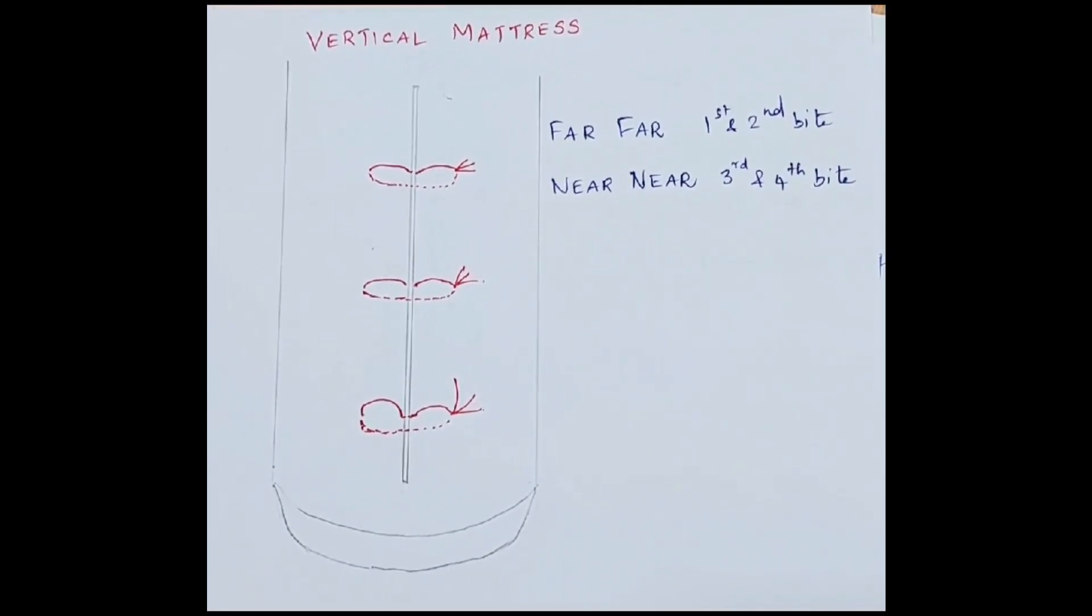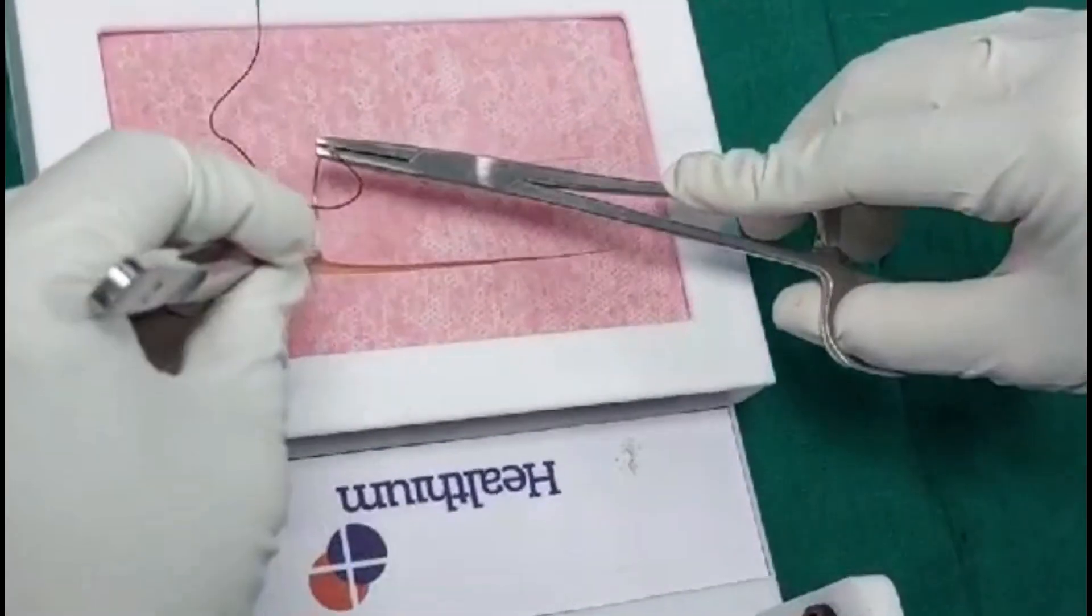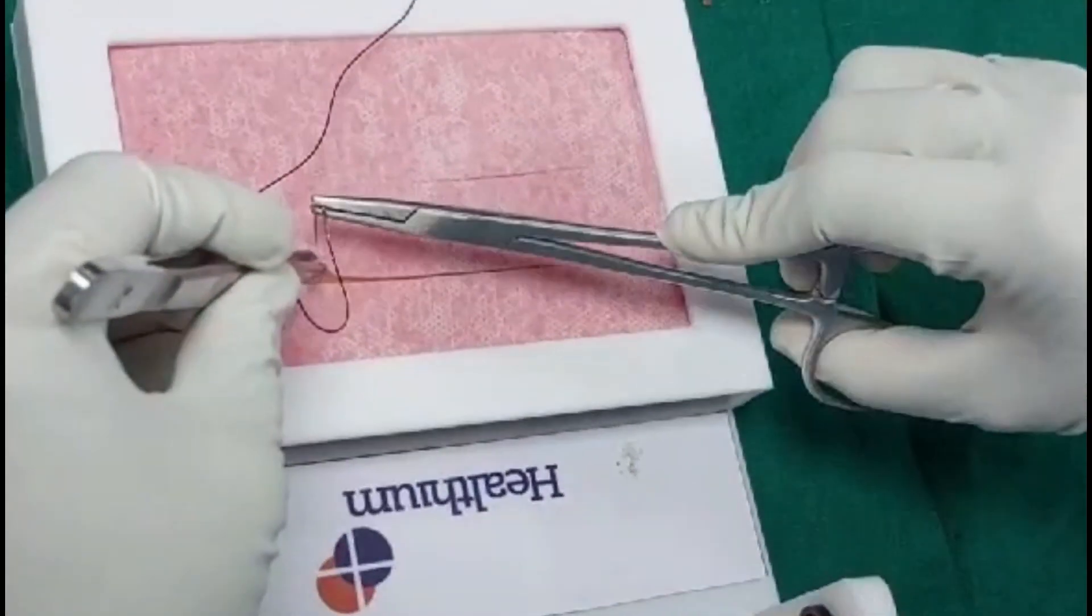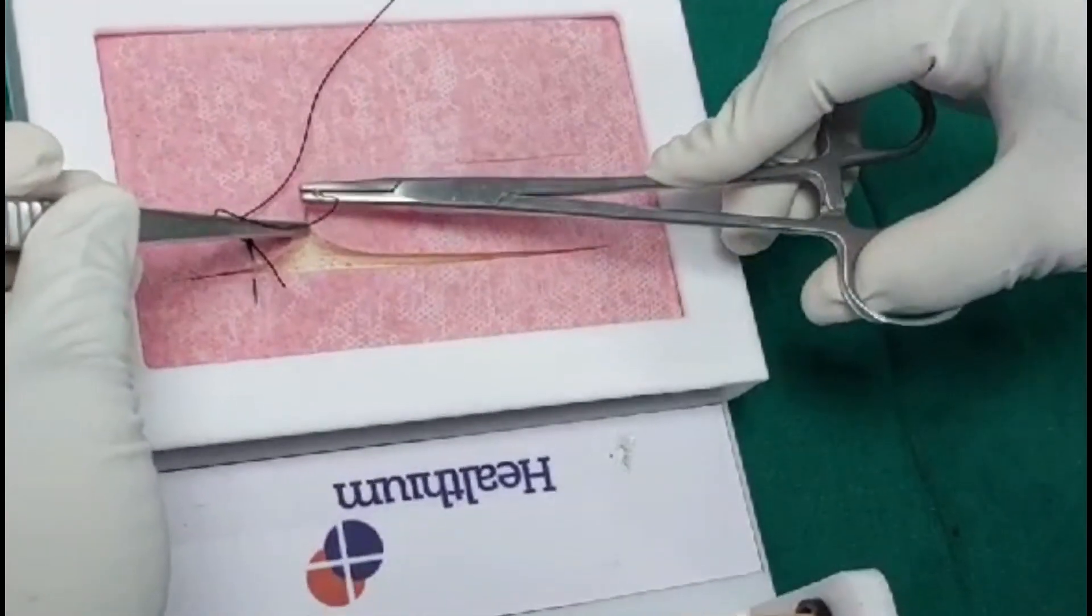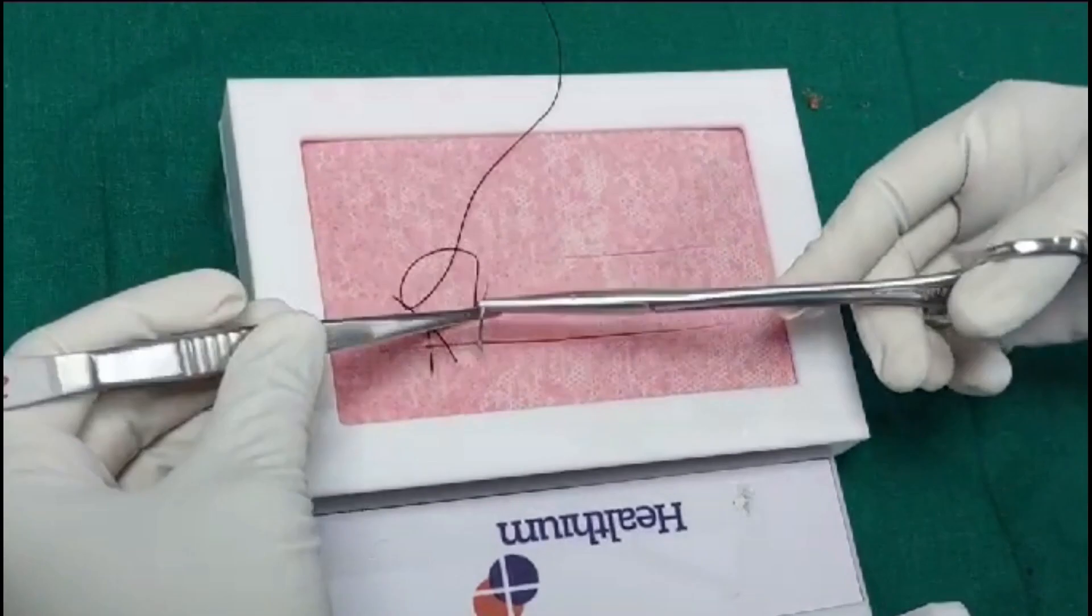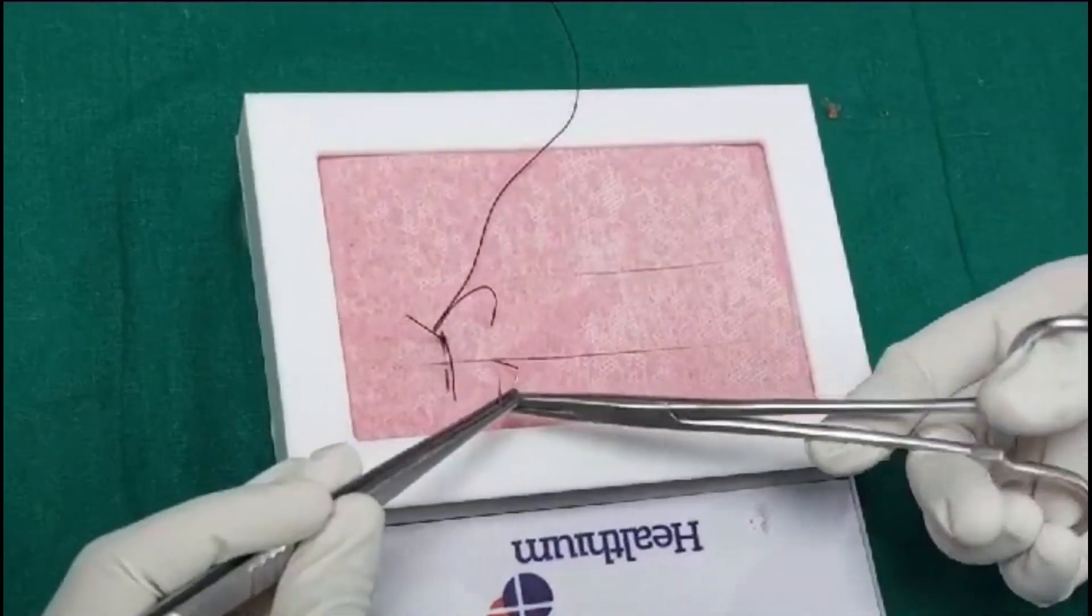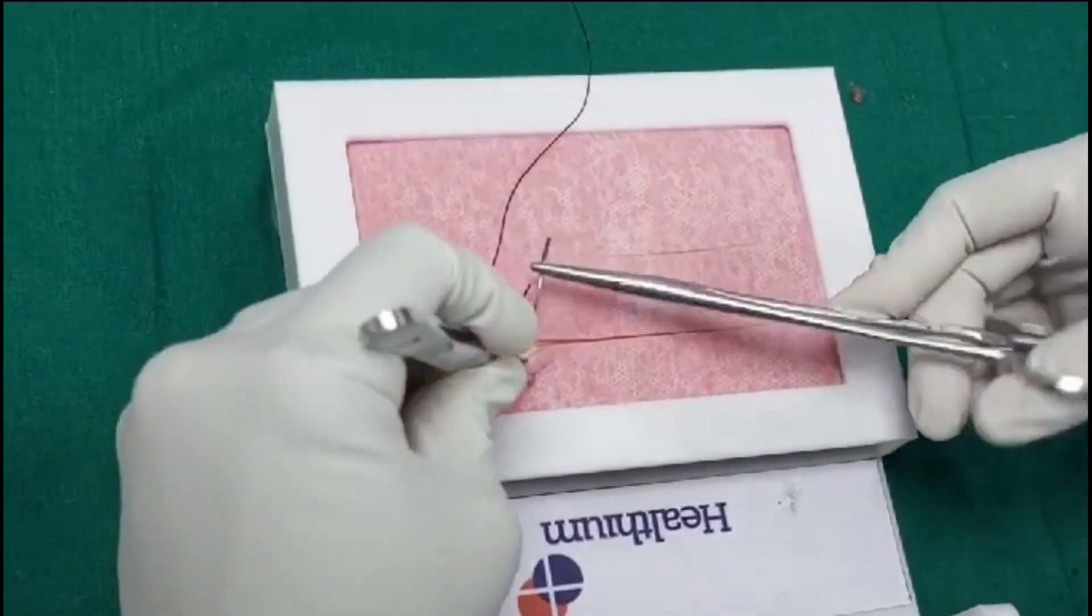First, far-far components are taken initially. First far bite is taken, the needle is removed by supination of the hand. Second far bite is taken directly across in a mirror image fashion on the opposite side.